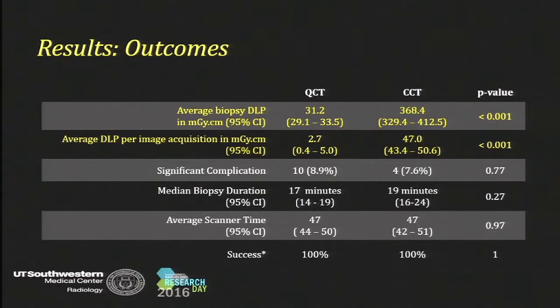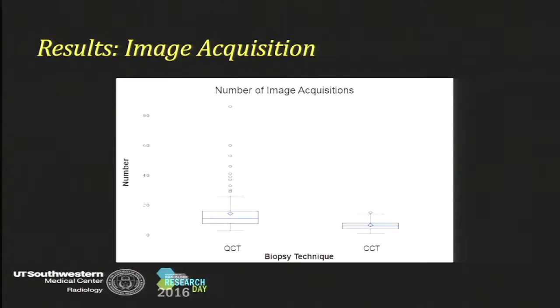In my experience, this QCT saves you a considerable amount of time going in and out of the monitor. It should save you time, but at the same time, what you're seeing here is you're adjusting it a whole lot more often. Theoretically, it should save you a lot of time. But what we believe is happening is if you have a trainee sitting there and you're teaching him, that time is offset. If you have a resident who hasn't done a lung biopsy for the first time at Parkland Hospital, you're teaching them, it's going to take a lot more time than if you have a very well-trained fellow at St. Paul who has placed needles multiple times before and says, all right, let's do this. But yes, I agree with you. It should save you time.